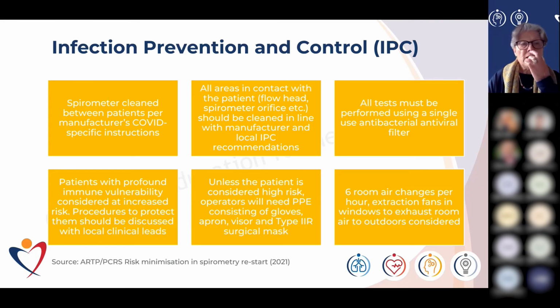So spirometers need to be cleaned between patients per manufacturer's COVID-specific instructions. So it's important that you contact the manufacturer of your spirometer and ask them for their COVID-specific recommendations. All areas in contact with the patient, so that's the flow head, the spirometer orifice, so that's the turbine, all those areas should be cleaned in line with manufacturer and local infection prevention and control recommendations.